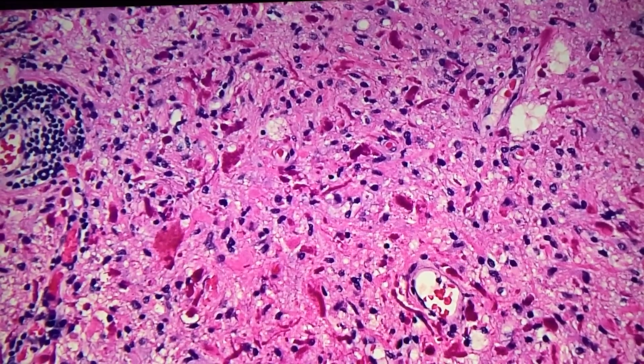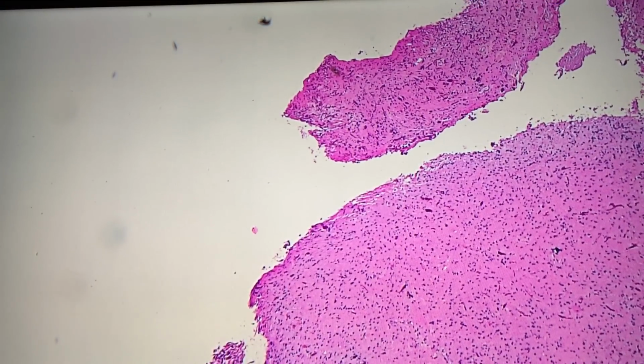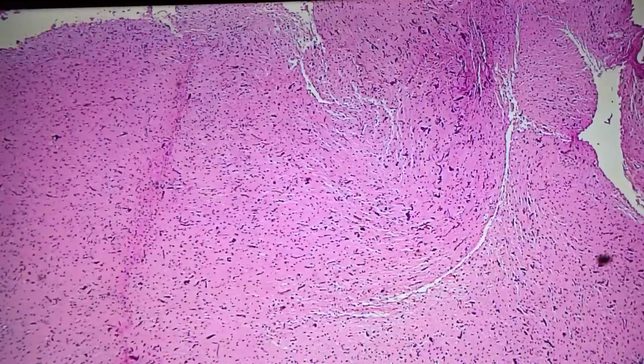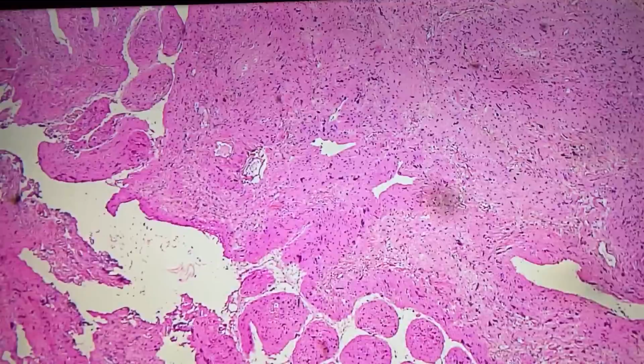So this is a nice case. Any take-home message from this one? If you see Rosenthal fibers within a glioma, consider a low grade, grade 1 tumor that's non-infiltrating. Okie dokie. All right. Let's do Imad. Let's give this case to you.